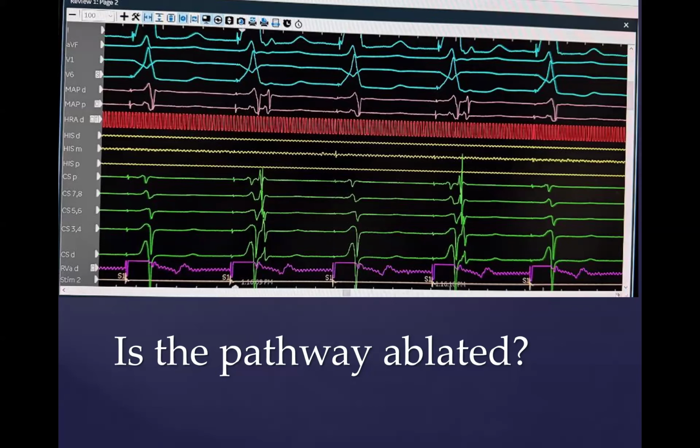So, how does radiofrequency ablation work? Some of you see that when I do cases, I use the most standard catheter, which is what's called a temperature-controlled ablation catheter. Essentially, the way the system works is you tell the system, I want to reach a certain temperature. In this case, the temperature usually is either 65 or 70 degrees Celsius. That's pretty much a standard RF temperature. The catheter has a closed loop and essentially will raise the power needed to achieve that temperature.